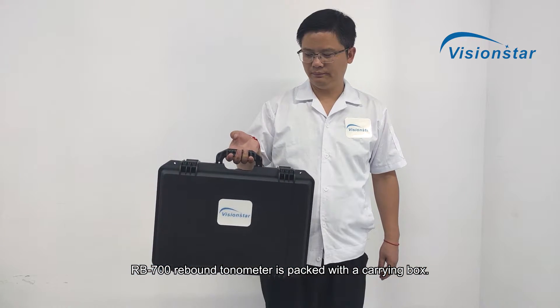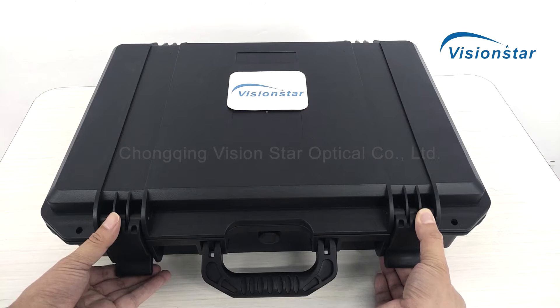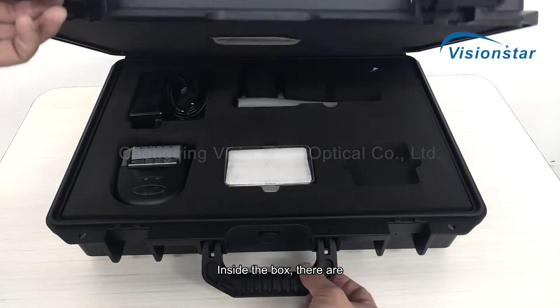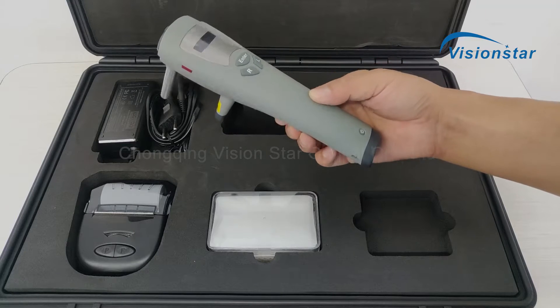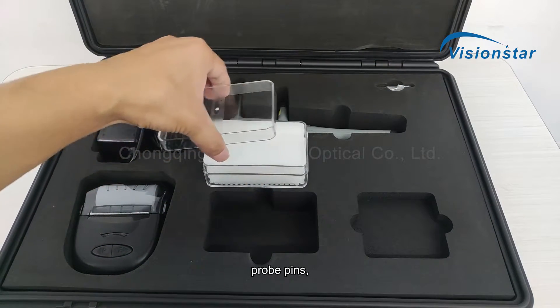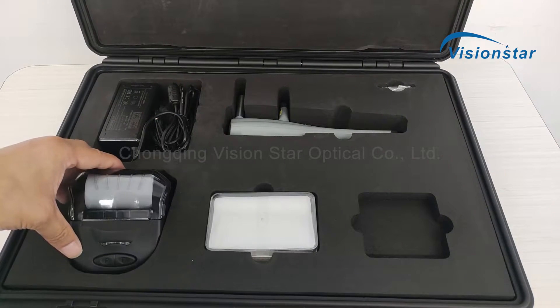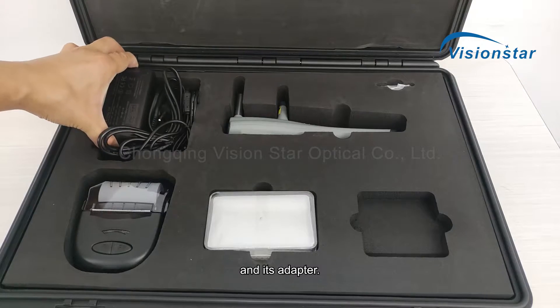The RB700 Rebound Tonometer is packed with a carrying box. Inside the box, there are the Tonometer, Probe Pins, an Infrared Connected Printer, and its Adapter.